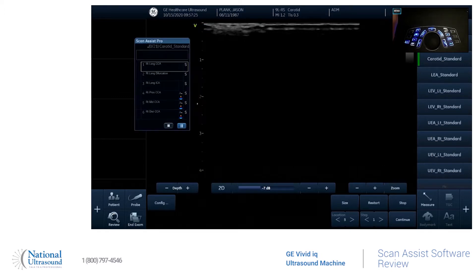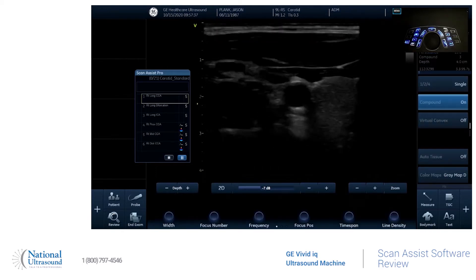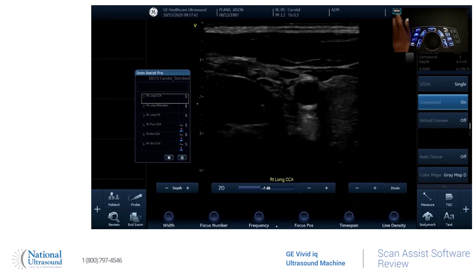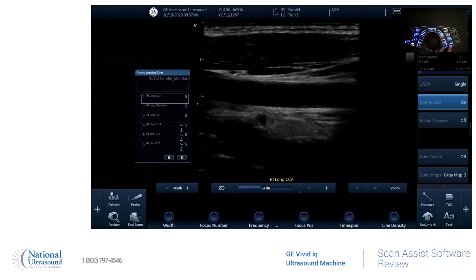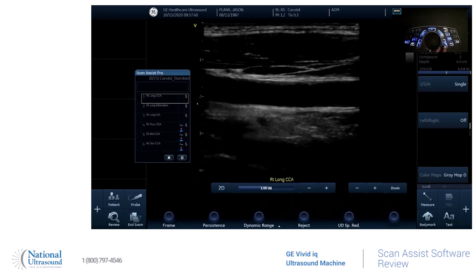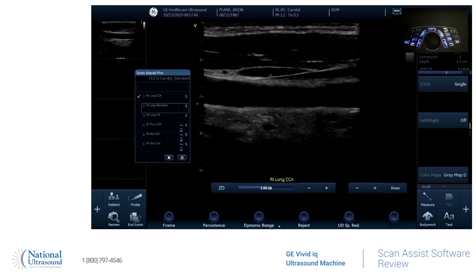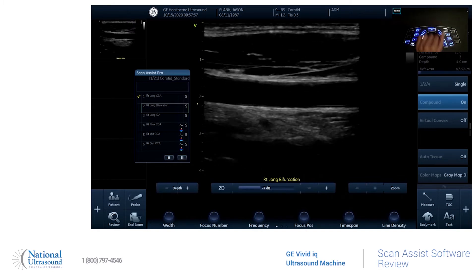These instructions you can move — it's touch screen — so you can get it out of the picture if you want to. And so if we start it. So it says right long CCA. So that text will be down there on the screen. And when you freeze and store it, it'll automatically go to the next step and it'll change your writing.